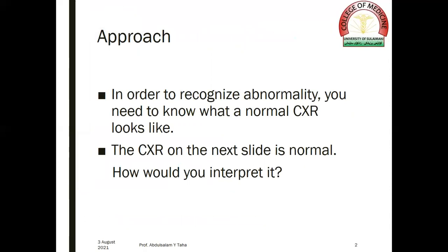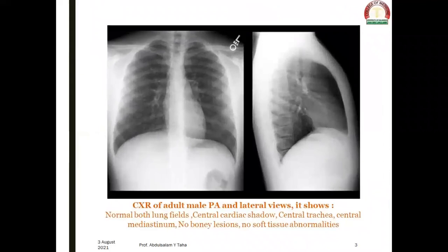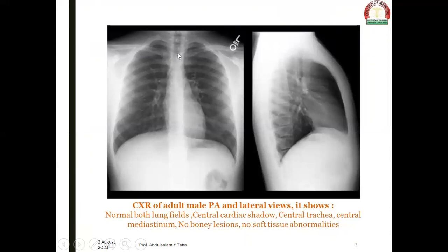In order to recognize abnormality, you need to know what a normal chest x-ray looks like. The chest x-ray on the next slide is normal — how would you interpret it? This is a chest x-ray of an adult male.